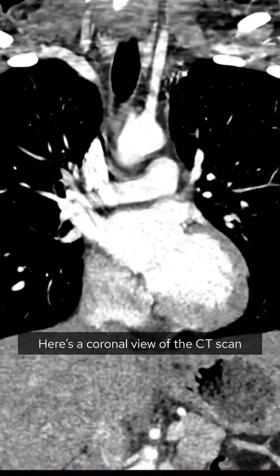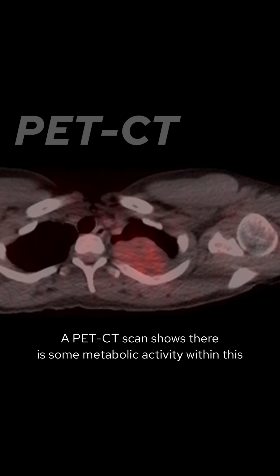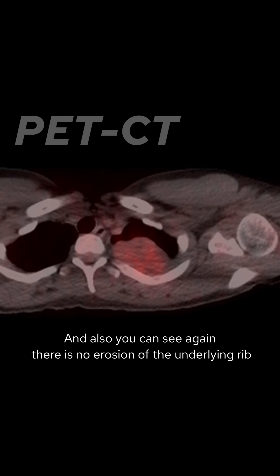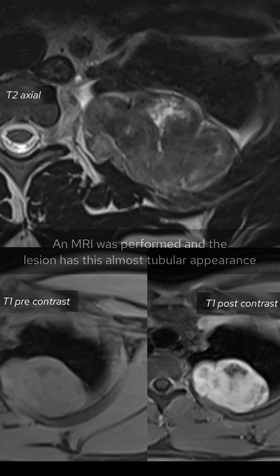Here's a coronal view of the CT scan, which confirms there is a mass at the left apex of the lung. A PET CT scan shows some metabolic activity within this, and again there isn't any erosion of the underlying rib.